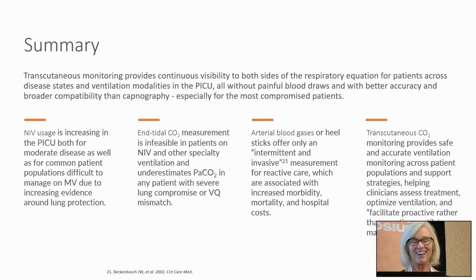It's okay. In summary, we know that we are using non-invasive ventilation more across all patient populations, not just the PICU and the NICU, but in the adult populations as well, and that we need to monitor patient CO2. We should start considering it like a vital sign. It used to be SpO2 wasn't a vital sign, but now we do consider SpO2 a vital sign. And CO2 really should be considered a vital sign as well.